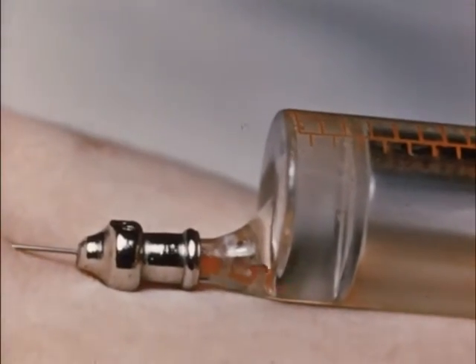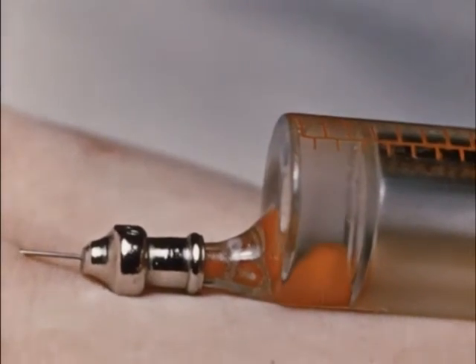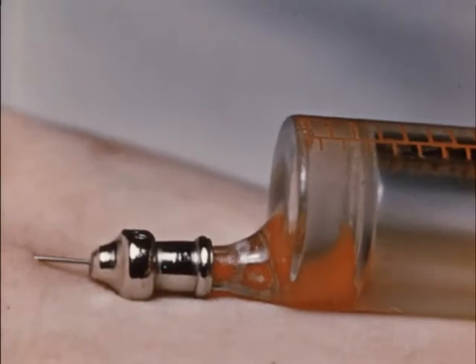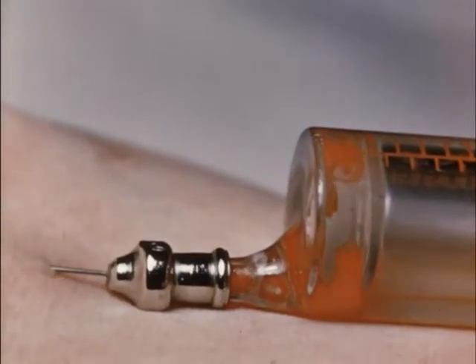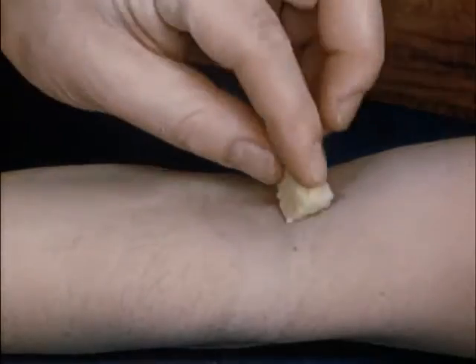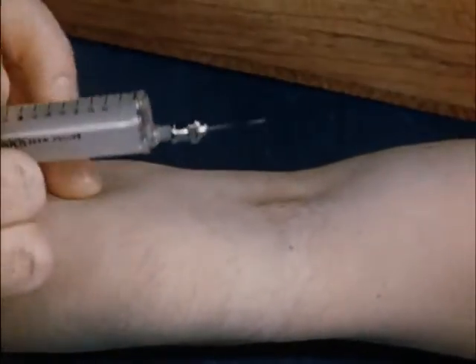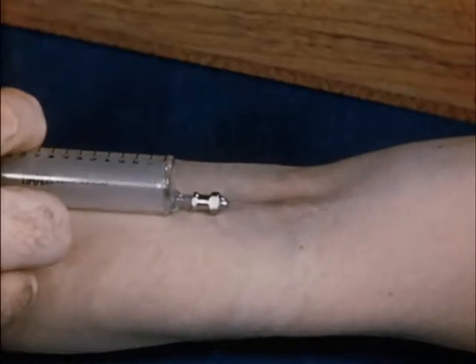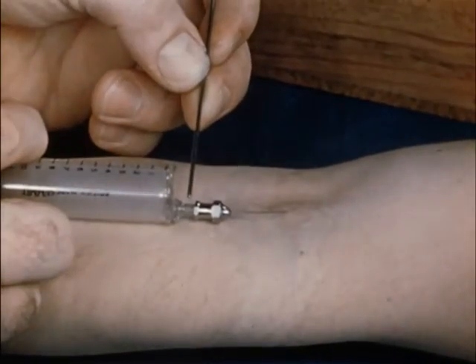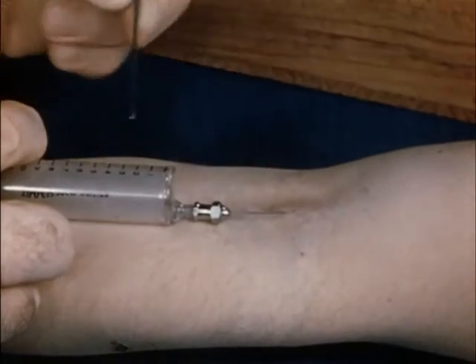A close-up, using instead a glass syringe, shows what could not be seen inside the metal head syringe. Using this all-glass syringe, blood need be withdrawn to the nozzle only and is returned at once to the vein without entering the main reservoir.